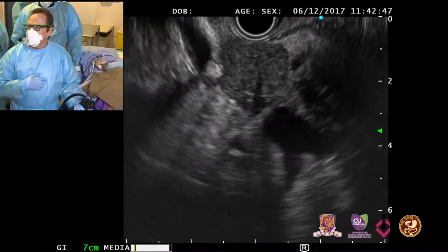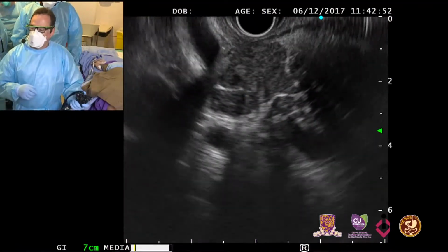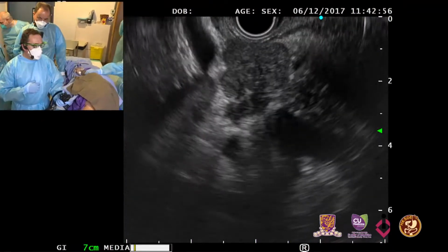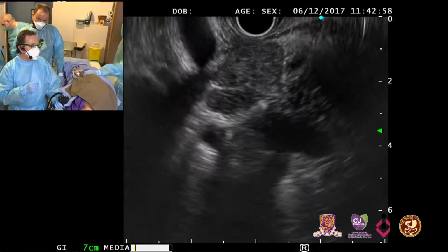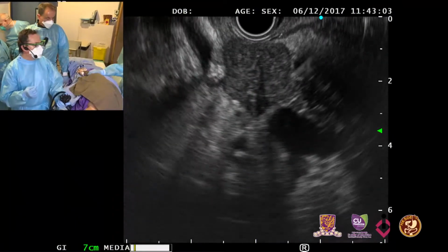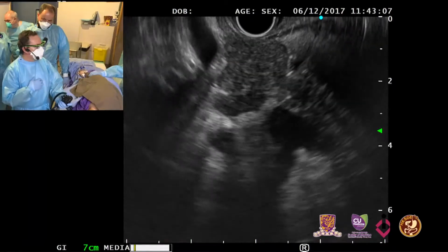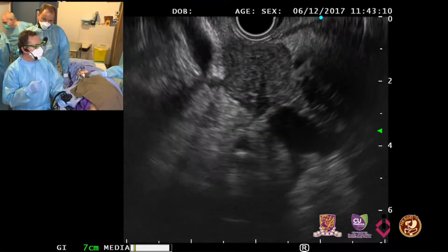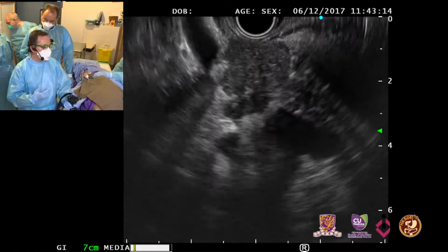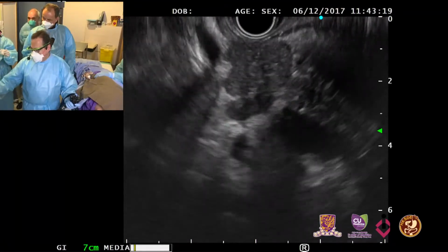Can we see the aspirate? I don't know if you have any questions so far. Irving, how important is on-site evaluation by histopathology or cytology? I think in general it's very important, but for nodes the accuracy of FNA is so high that in my unit, unless it's dramatic, we don't usually call the cytopathologist for a lymph node. But obviously for solid masses, we think it's extremely useful and important if you have it.